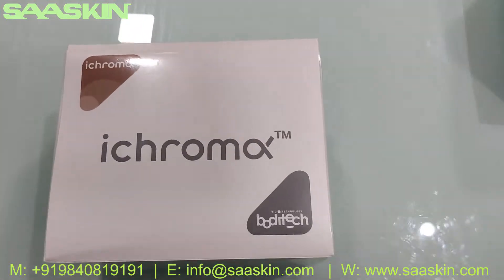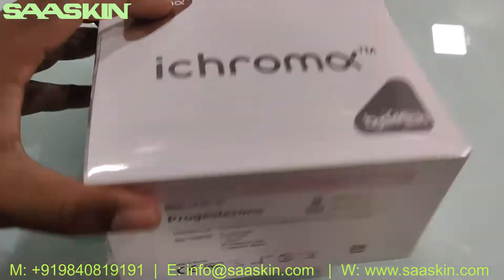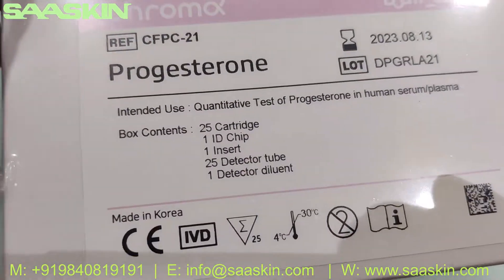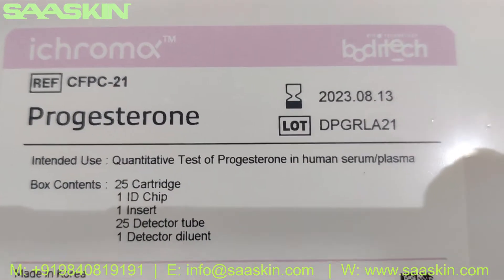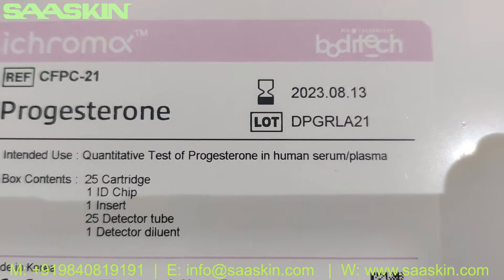Hello everybody, today we are going to see the unboxing of the iCHROMA PROGESTERONE test kit from Bodhi Tech. This is a CE certified product, made in Korea. This is the iCHROMA PROGESTERONE kit for the quantitative test of PROGESTERONE in human serum and plasma.